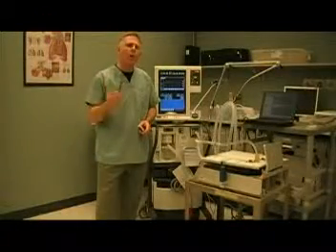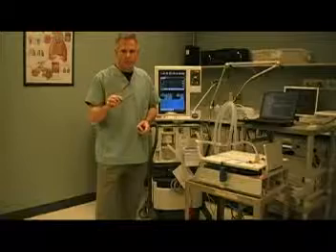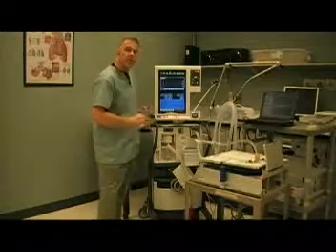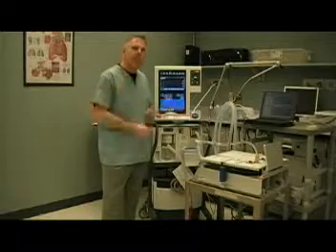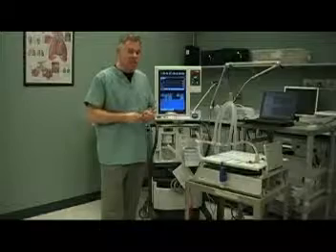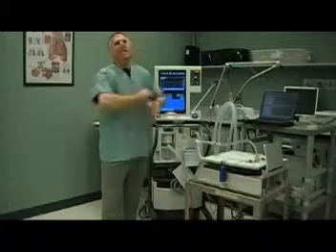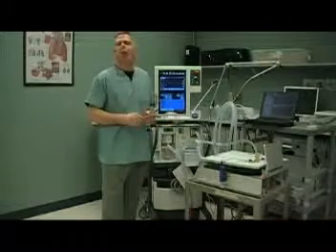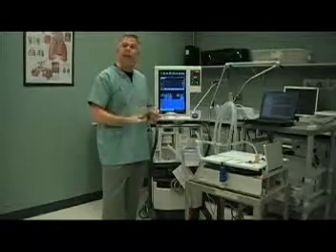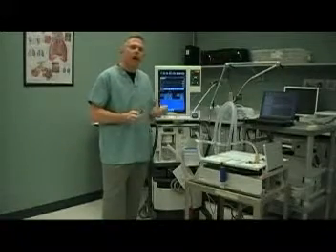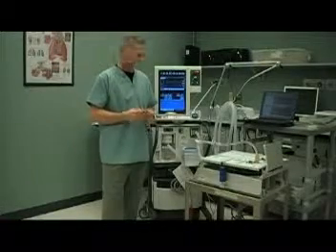Some key things to remember about volume control continuous mandatory ventilation, CMV: our goal is to do most of the work of breathing for the patient and to deliver this volume or minute ventilation regardless of patient lung characteristics. This is a nice initial mode for your patient because when you don't know anything about them, you may want to override any lung disease or problems to make sure they're getting a normal minute ventilation. That's why we've defaulted to an average tidal volume, an average rate, and an average flow rate.